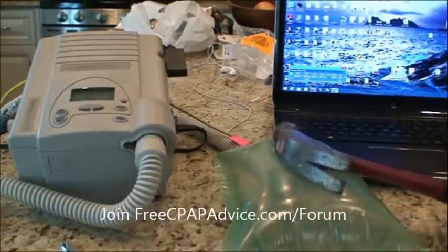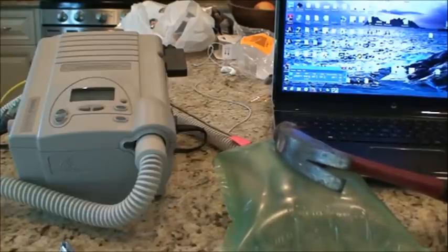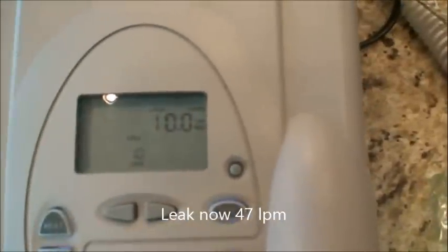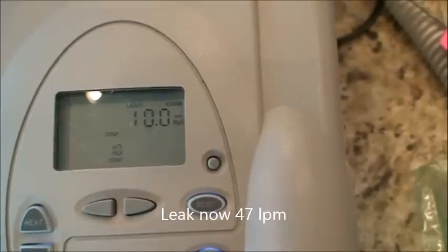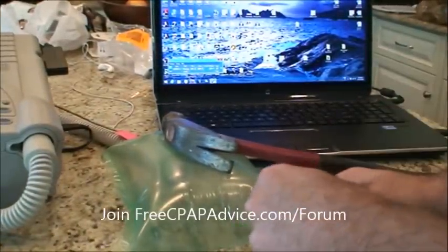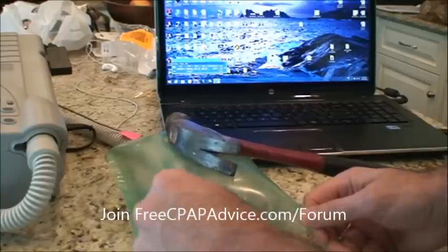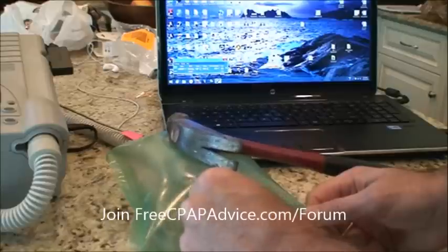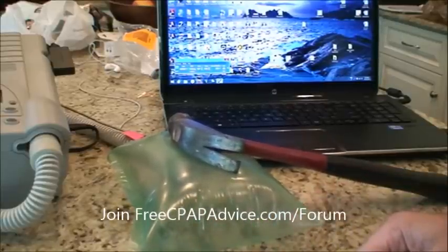Okay, so what we're trying to do is we're trying to stress the system here. Okay, so now we have a leak of 40. We're trying to stress the system and see where CPAP cannot keep up. You can see right there, everything's all hunky-dory. It's still being able, it's catching up to that leak and it's keeping it pressurized. So we're cool. Let's add more leaks. Add a ton of leaks.